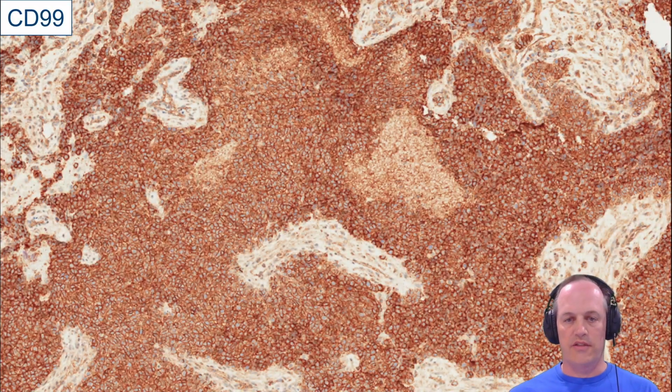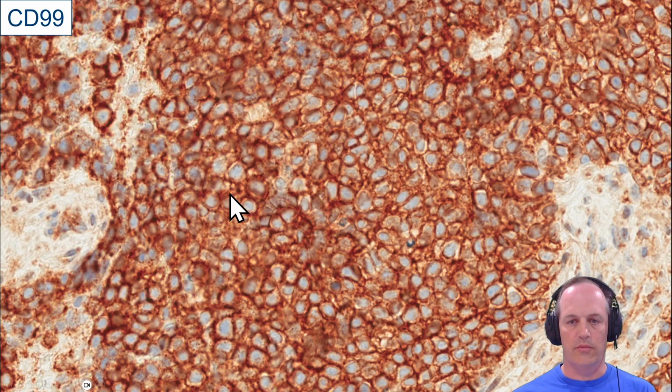Now, immunostain-wise, CD99 is the prototypical stain. If you have a tumor that looks like that and stains like this with CD99, you're going to call this Ewing sarcoma all the time. And when I say stains like this with CD99, what do I mean? This looks like stained glass. Very solid, contiguous CD99 reactivity around all these cells throughout the whole tumor.